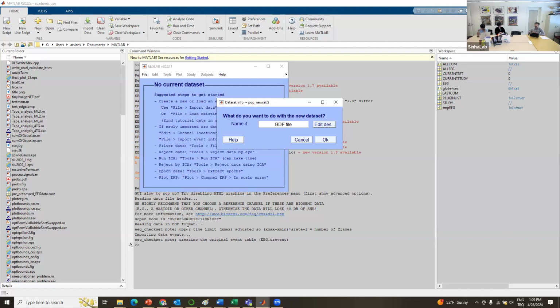So depending on your setup, you may want to import your events, labels, or event locations from external data, maybe an external text file could be a potential format for that. But again, it depends on your setup and on the inner workings of your device.